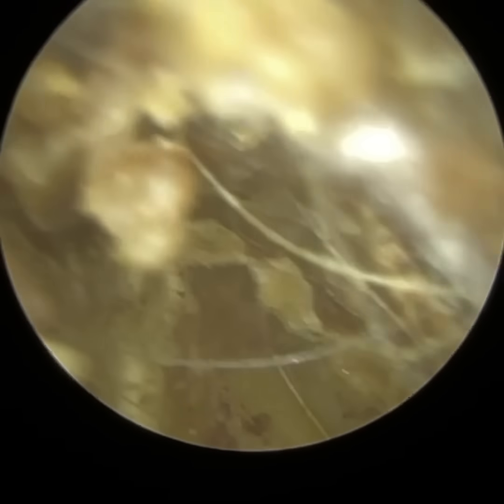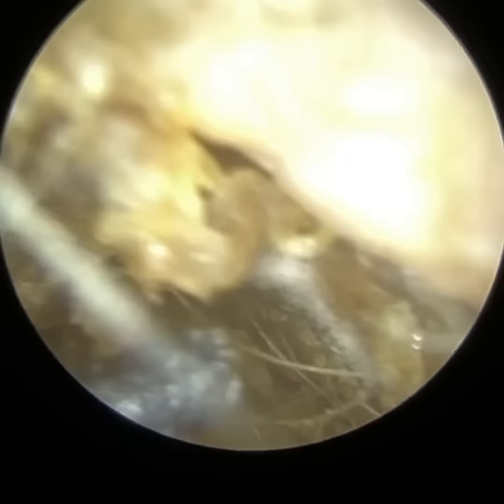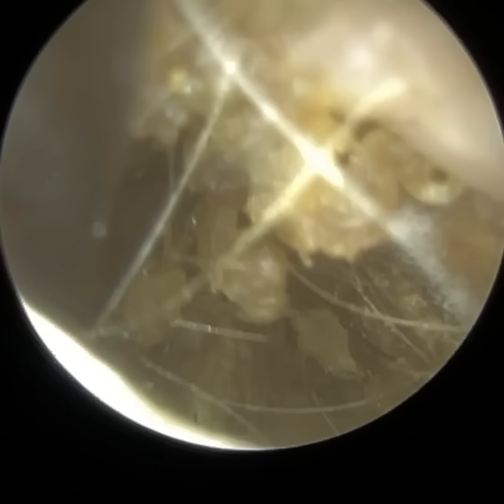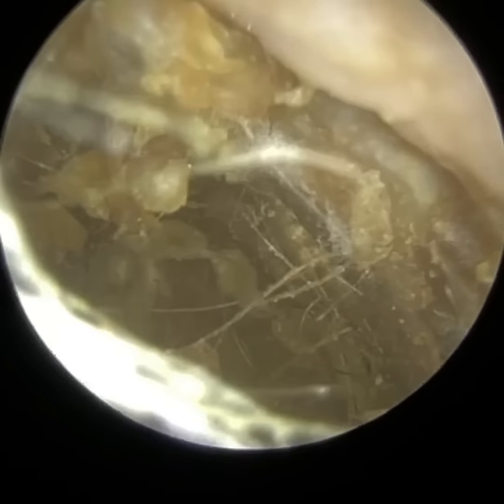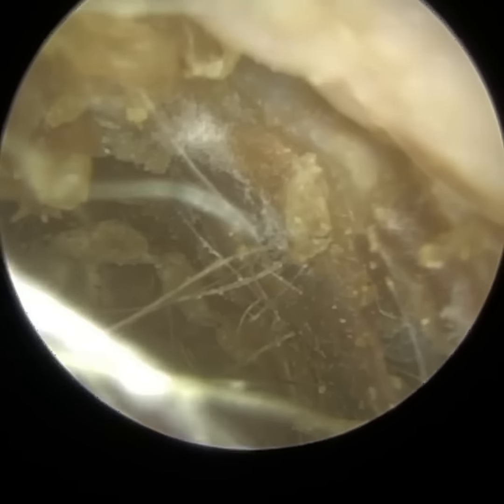Thank you for joining me in my latest video using the iClearScope endoscope, and I have a really interesting case for you guys. It's of a patient who suffers from chronic otitis externa. The term otitis externa is an umbrella term given to inflammation and/or infection of the external auditory meatus, also known as the ear canal. But it can also include the auricle.